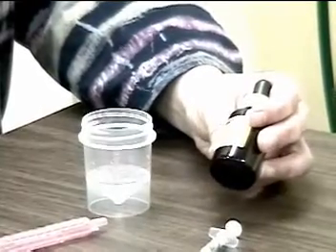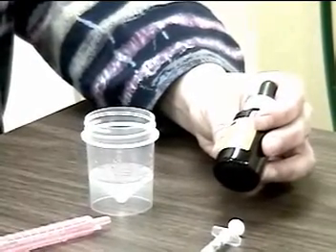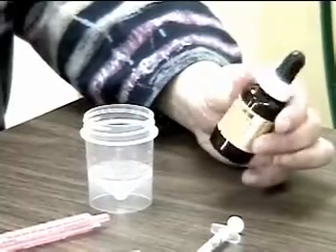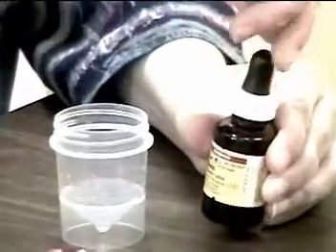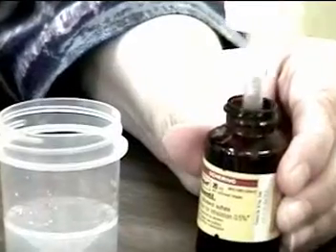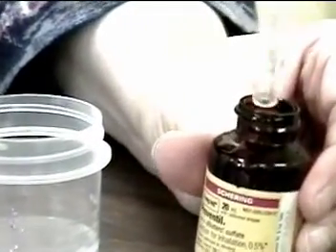I'm going to look at the expiration date to note if it's okay to use. As I go to remove the cap, I'm going to look at the label once more as a means of checking to make sure I have the right medication.